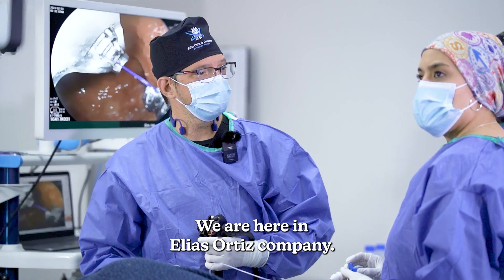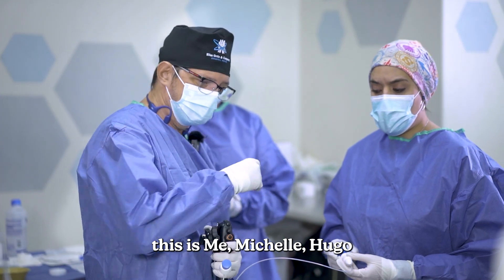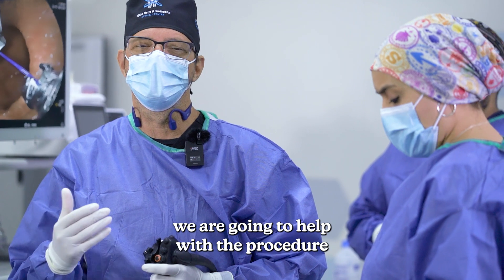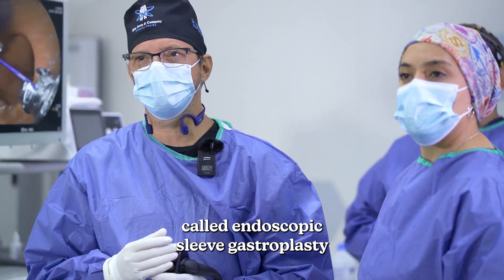We are here in Elias Ortiz's company. It's me, Michel, Hugo, our chief anesthesiologist. We're gonna help with the endoscopic procedure called endoscopic sleeve gastroplasty.